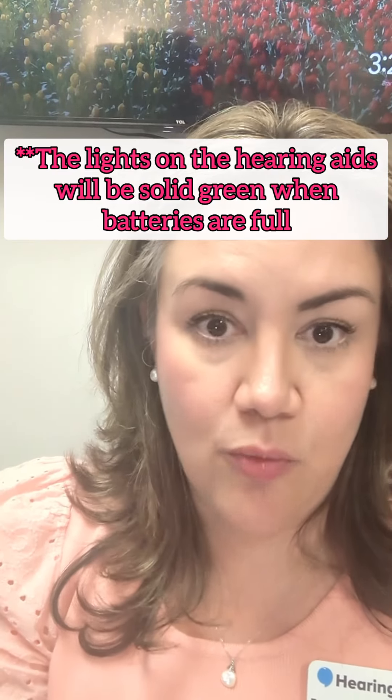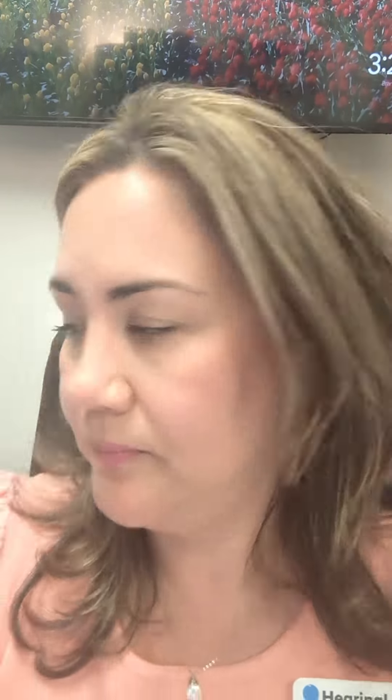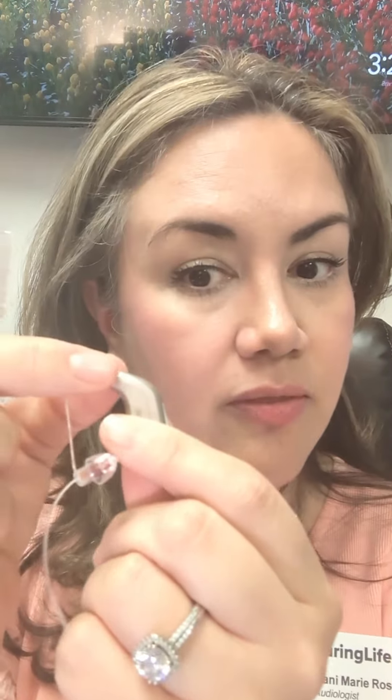Leave them in there — they're going to charge overnight. It only takes a few hours to go from zero to a hundred percent. About once a week, we're going to brush over those microphones and the button. The microphones are the little holes on the neck and back of the hearing aid, so just give it a nice little brush there. About once a week is good.